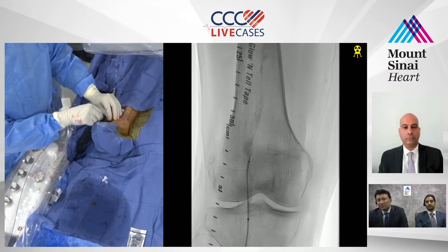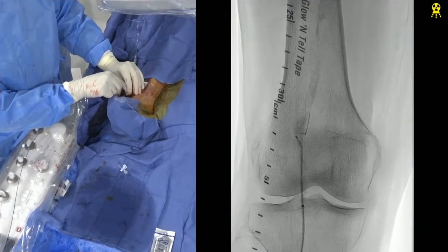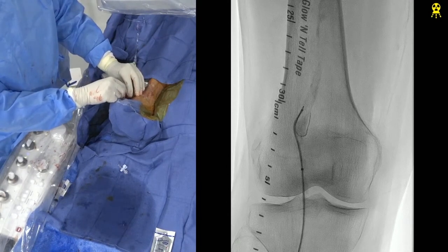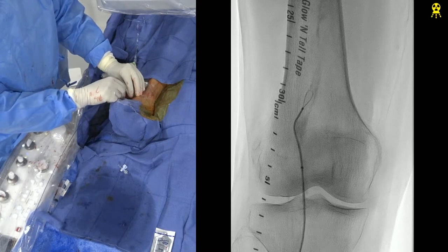So I think I would try to do an endarterectomy. If we can't do it endo, I would go in having a high suspicion that I might not be able to get a good plane and remove all the plaque, and either would have to remove that segment of the artery and do an interposition graft. And then I think I would probably stage it, to be honest. I would probably just fix the common femoral and then see how she does after that.